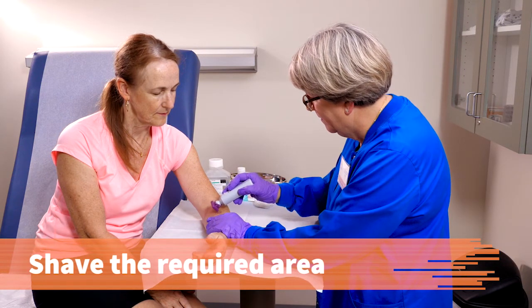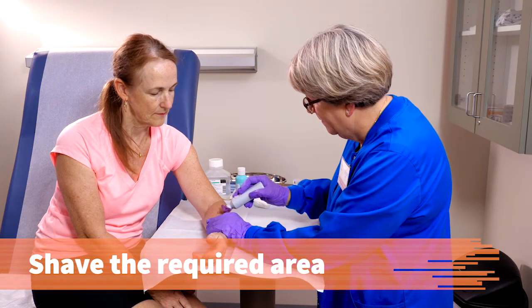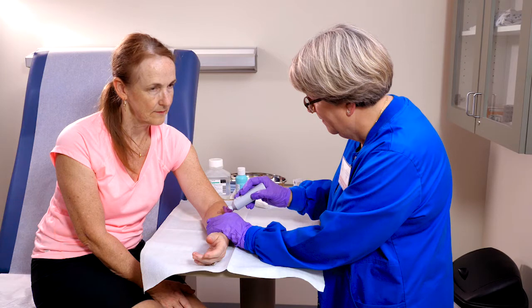Shave the required area with electric clippers. Shave carefully over the cyst area. Follow standard precautions regarding disposal of sharps.